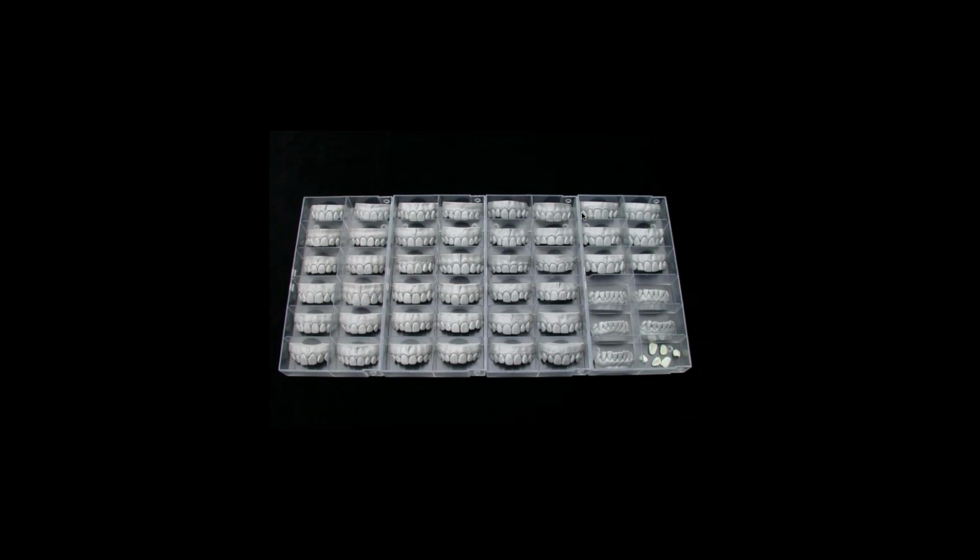When I do my diagnostic wax-up, I really like to copy something, and this is the best way, because you have different shapes: you have oval, you have triangle, all kinds of different shapes of the tooth.